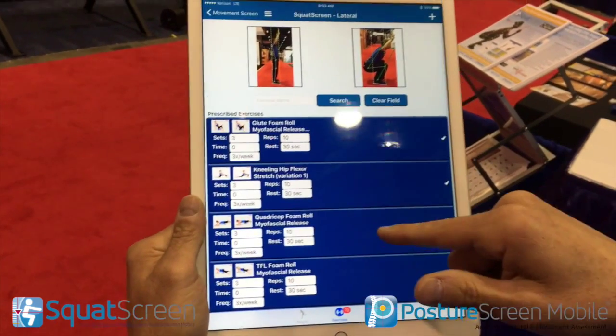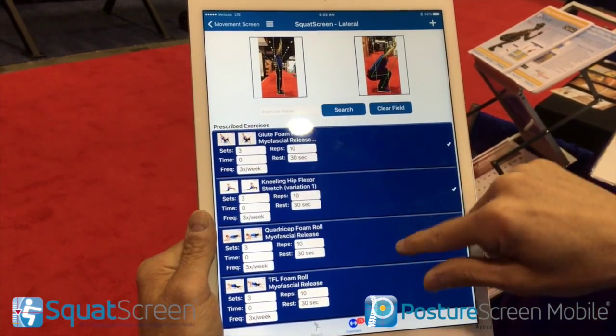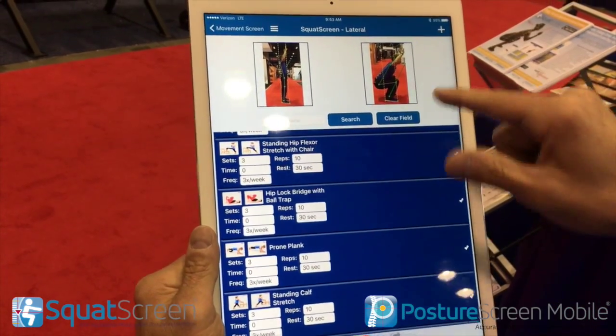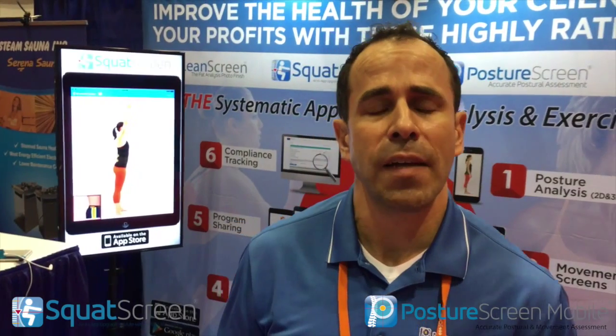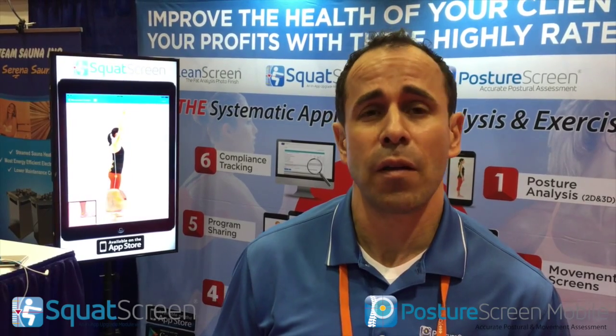Automatic exercise prescriptions in the palm of your hand. All you have to do is narrow down the scope — these are all exercises that can be prescribed for these faults. This is available right now within Posture Screen Mobile. The exercise linkage to our movement screens will be out in about a month. Check it out on the iTunes App Store, available for iOS on the iPad. For more information, reach out to us at support@posturescreen.com. Thank you.